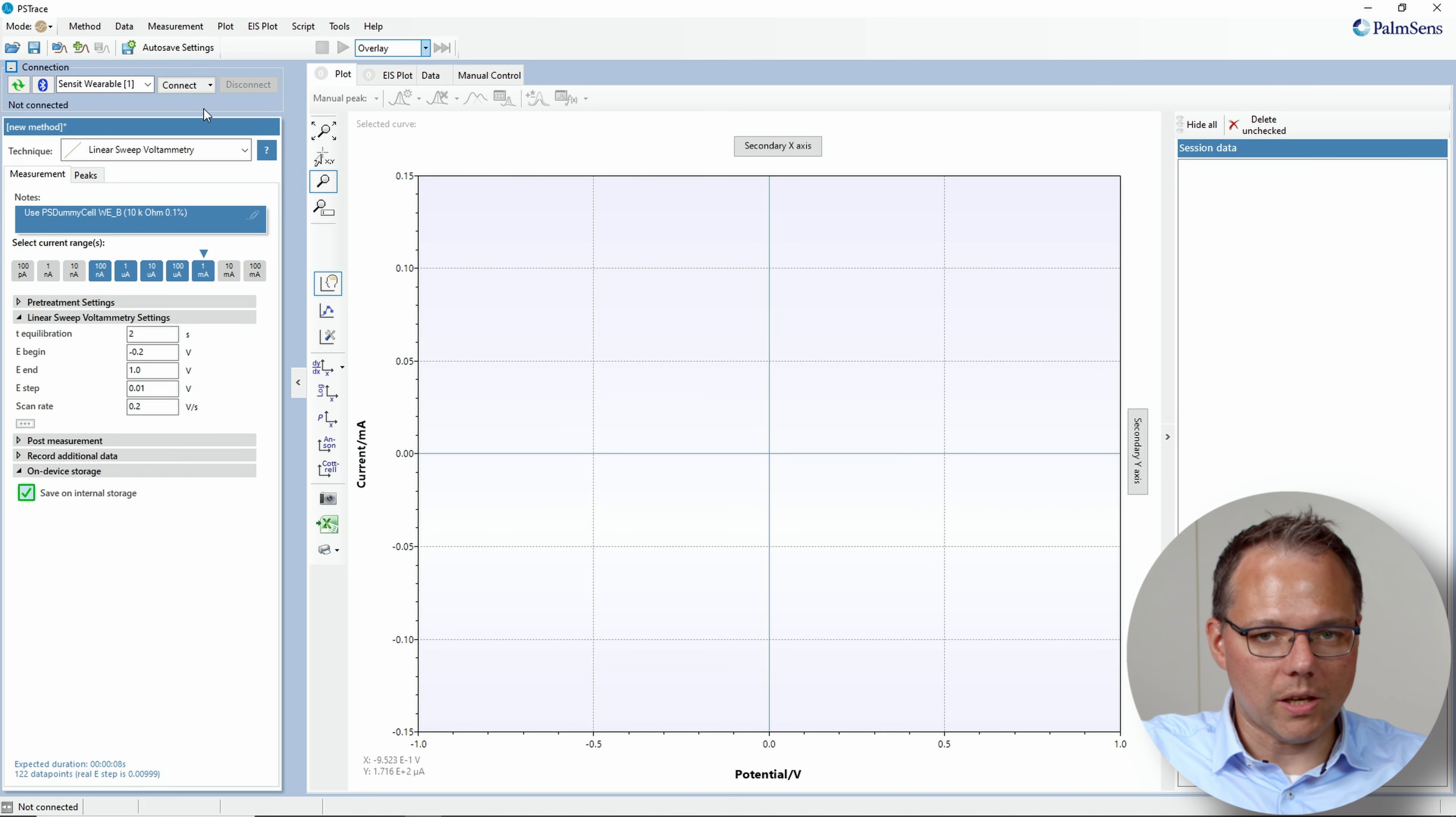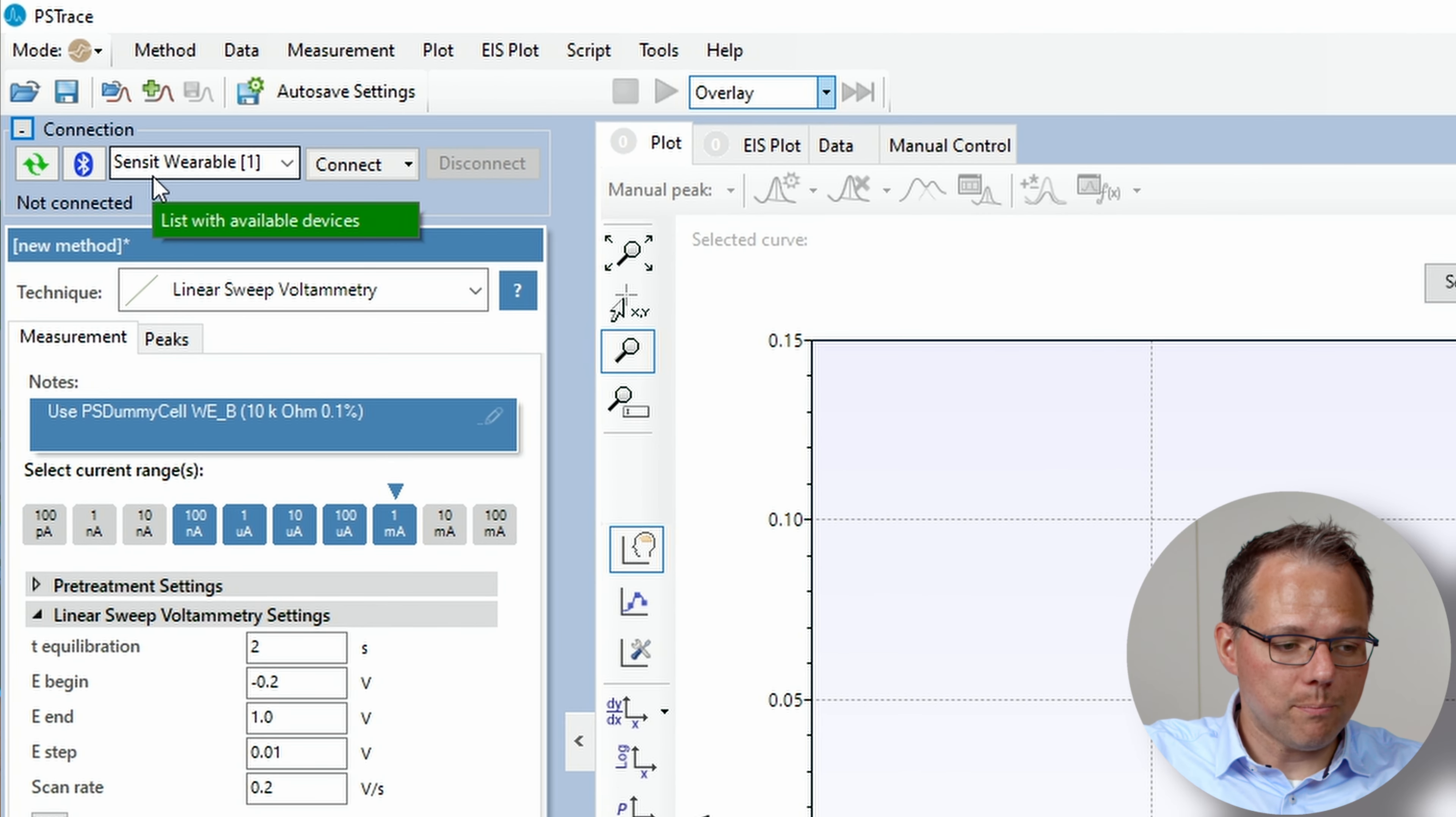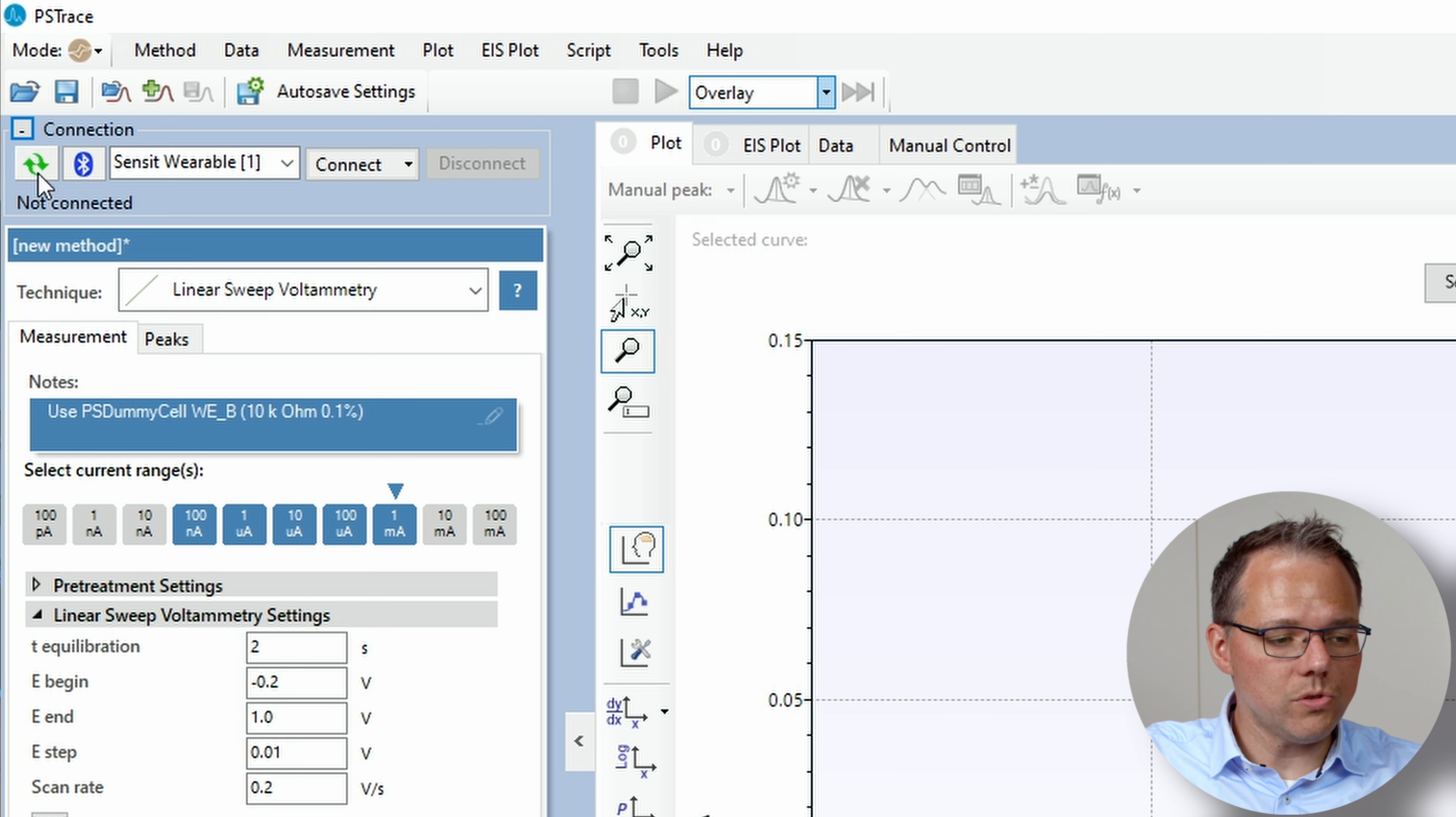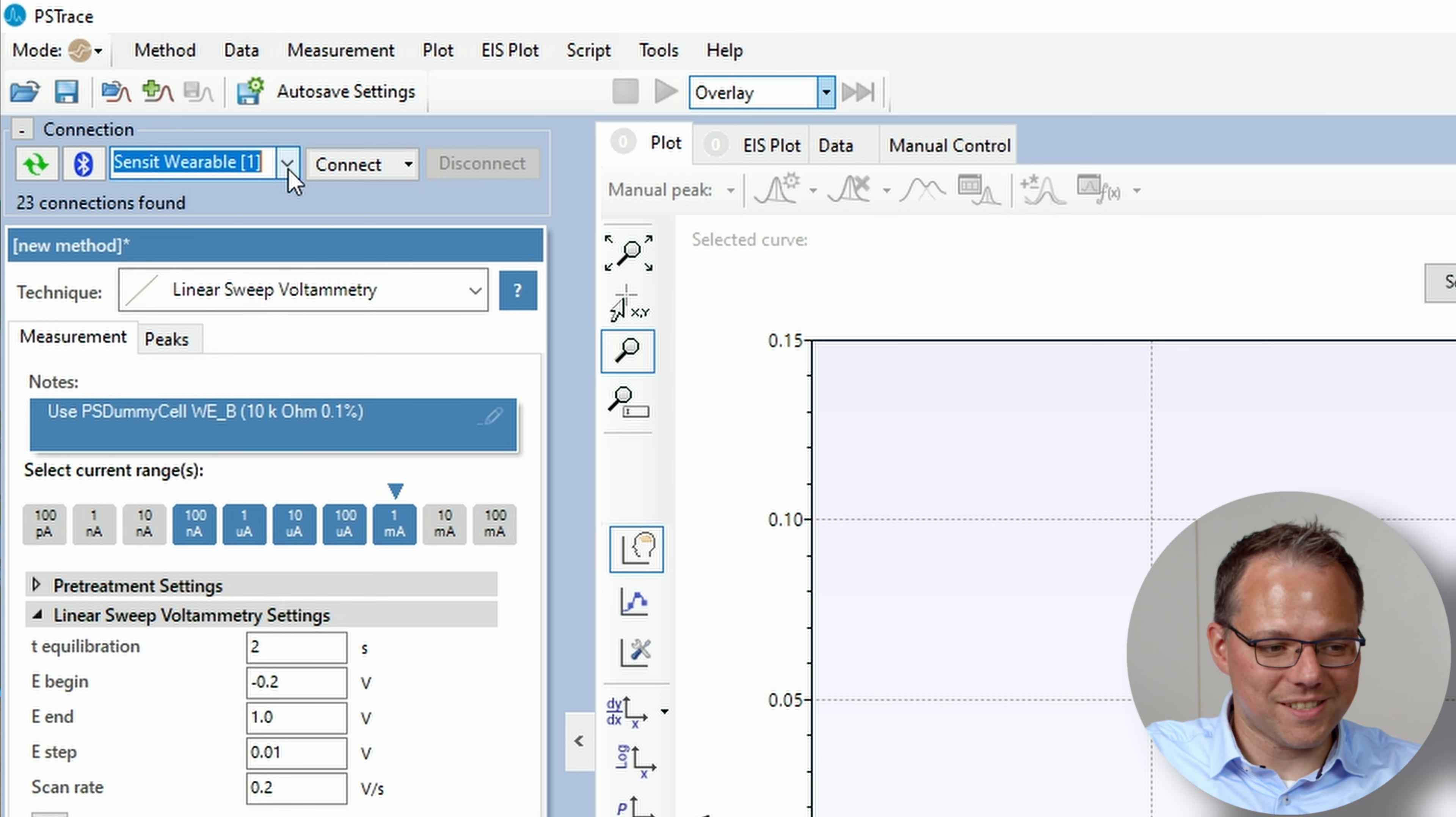Okay have a look at PS Trace. First I need to connect to my Sensit wearable. Usually you should see already here in the drop down menu the Sensit wearable. If you don't just press the refresh button and the name most likely will appear or you need to select it from a list.